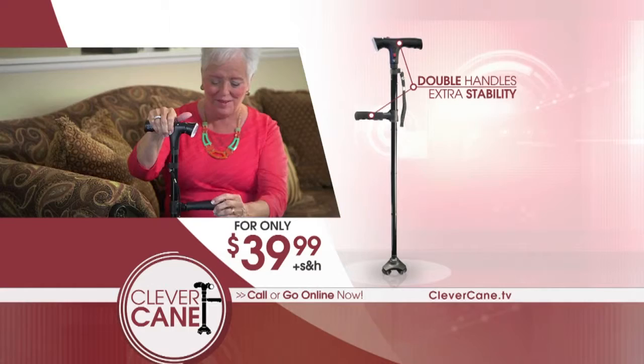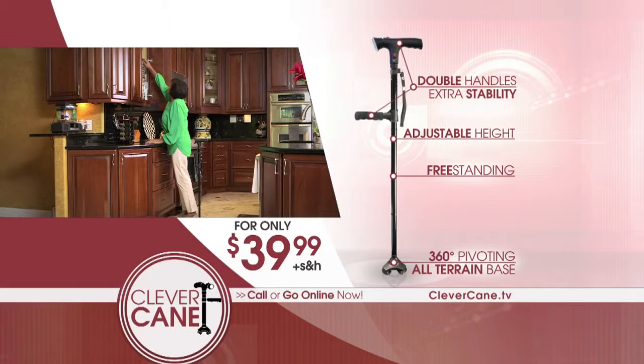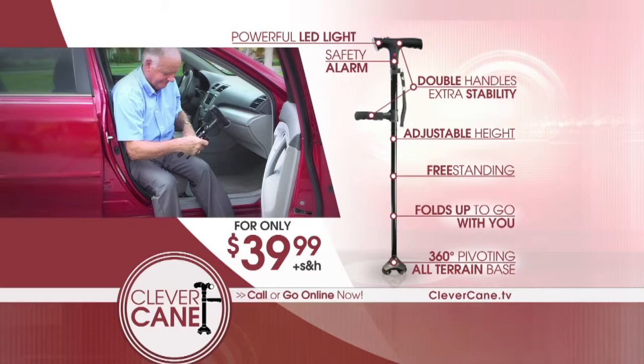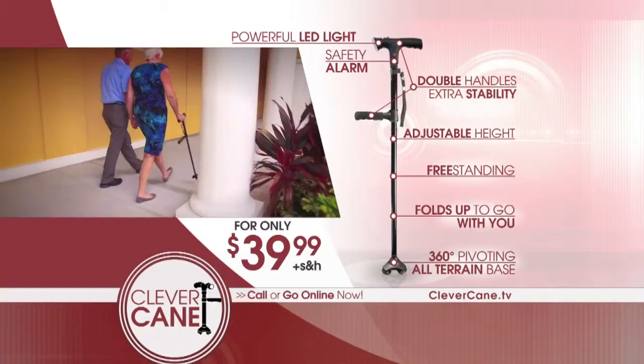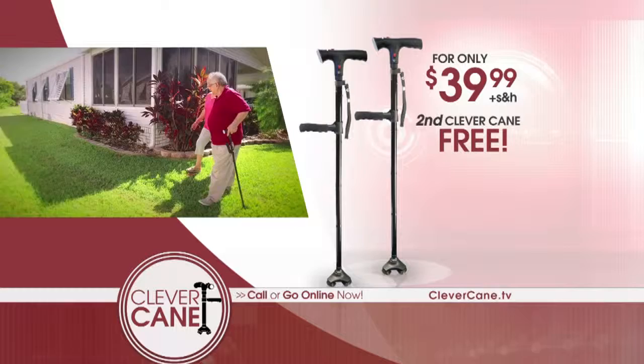The Clever Cane has double handles for extra stability, adjustable height with five settings, an all-terrain 360-degree pivoting base. It stands by itself for when you need both hands. It has a powerful built-in tilting LED light for nighttime and low-light conditions, a safety alarm for emergency situations, plus it folds up to go with you for complete versatility — all for the low price of only $39.99. If you call right now, you can get a second Clever Cane for free. That's right — two Clever Canes for the low price of only $39.99. So take advantage of this incredible offer and call or go online now.